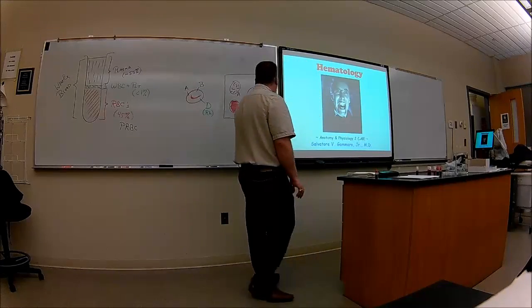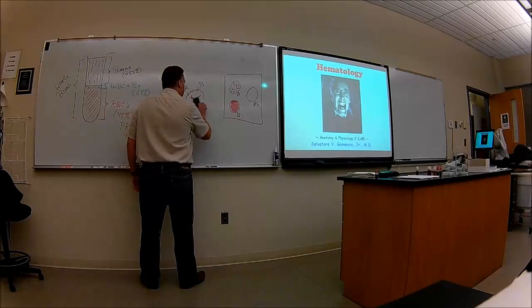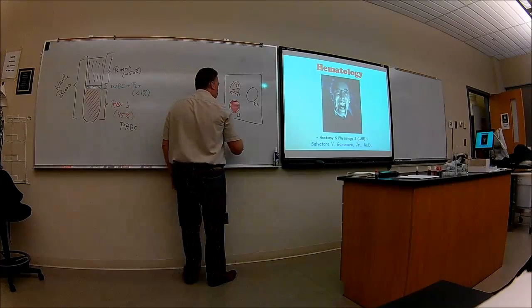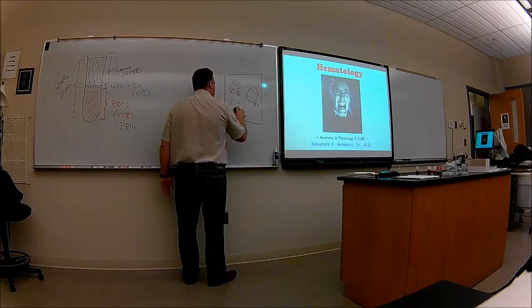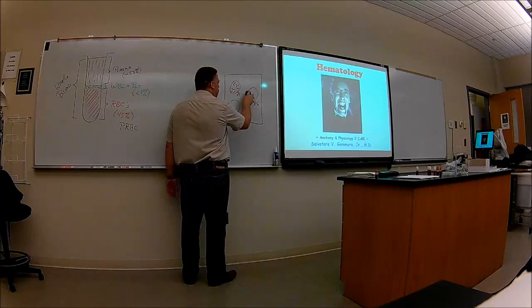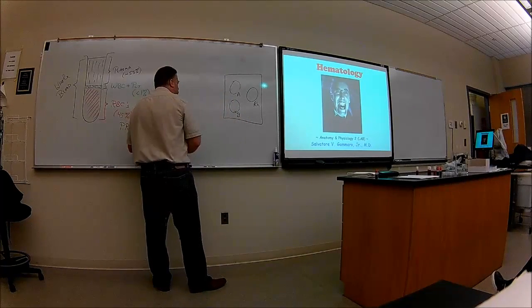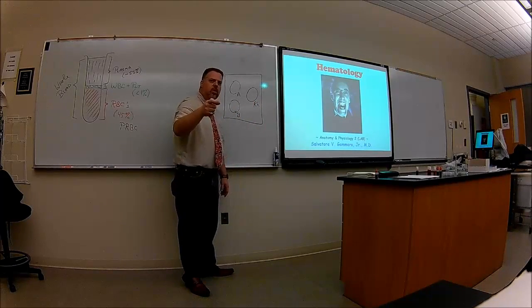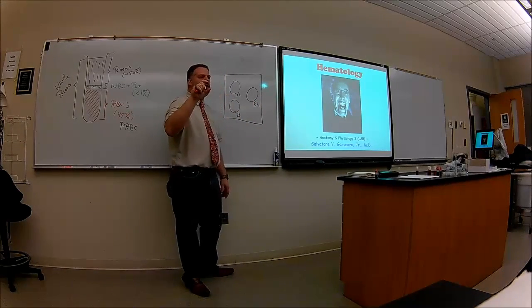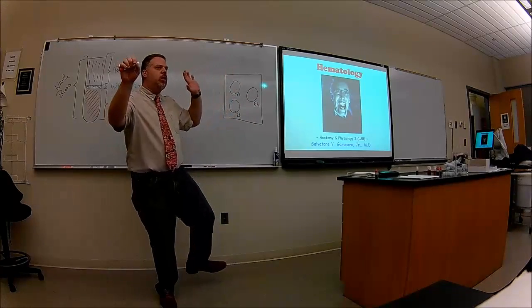All right, let's now throw in the other thing. It's the same thing when we're dealing with Rh antibodies. You're going to put 3 drops of antibodies to Rh in here, and now you've got antibodies to Rh there.